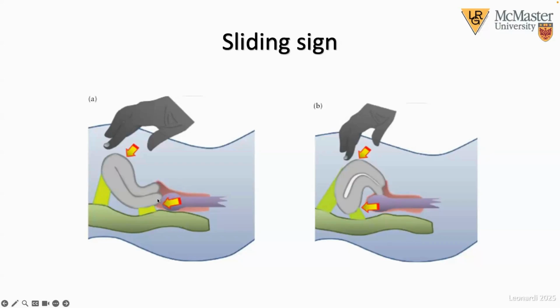So we have the sliding sign, which is applicable in both an anteverted and a retroverted uterus. And we look at the adhesion state behind the retrocervix and along the posterior uterine serosa. In this particular case, the IDEA group created an anteverted retroflex uterus. Essentially here, the utility of the IDEA sliding sign is at the fundus, but there is another area back here, which I'll share with you in a moment.